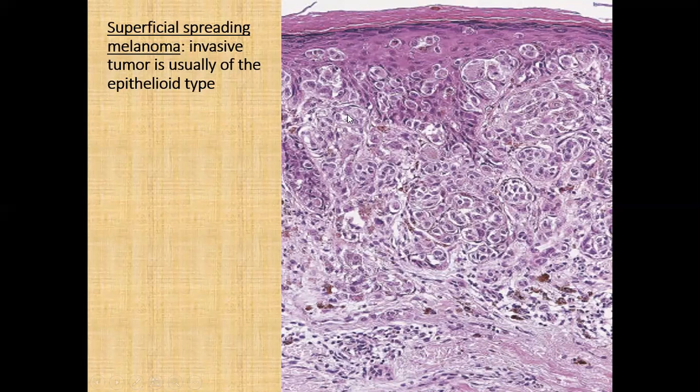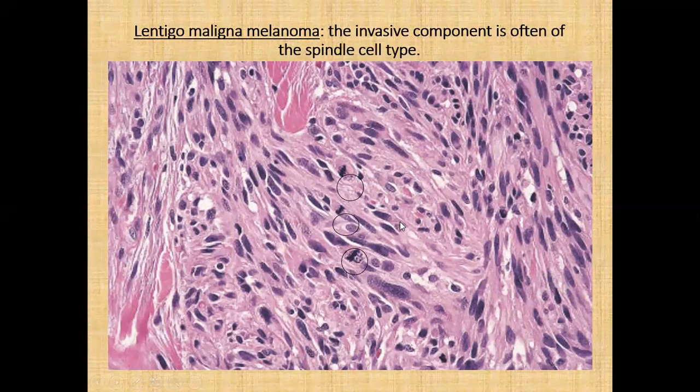Superficial spreading melanoma, when it enters the vertical or invasive growth phase, is characterized by abnormal looking melanocytes seen in the form of junctional nests, along with nests of abnormal cells in the upper and mid dermis. In lentigo maligna melanoma, similar nests of melanocytes are seen within the upper dermis, but these nests will be spindly in shape. They will have spindled or tapering nuclei and lots of mitoses.